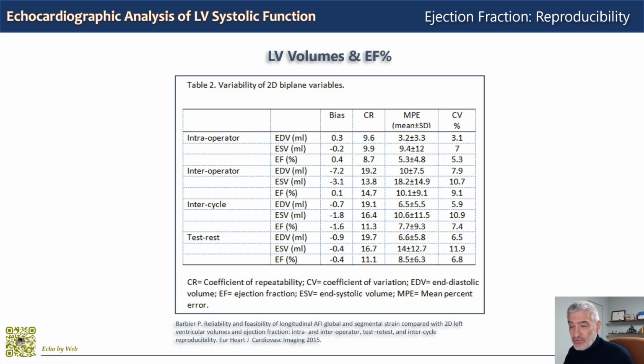And this can be due to different factors. Also because previous series were quite old, so 2D imaging in this series is much better. The resolution of the machine was much better than previous series. And for your information, let's see some definitions for the statistical tests that were used for this analysis.